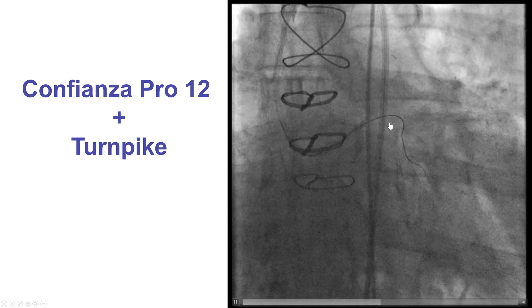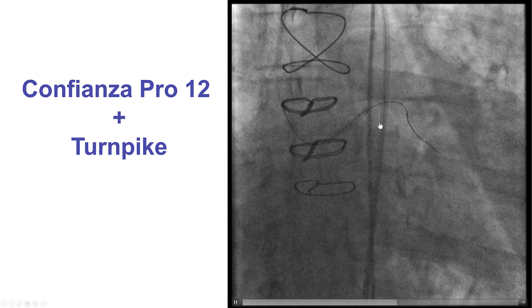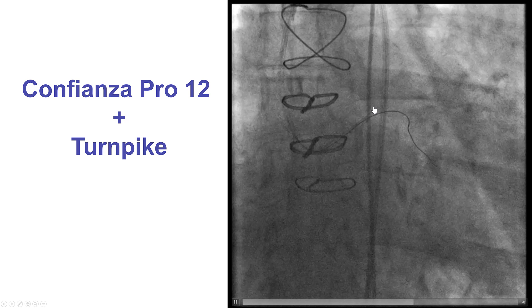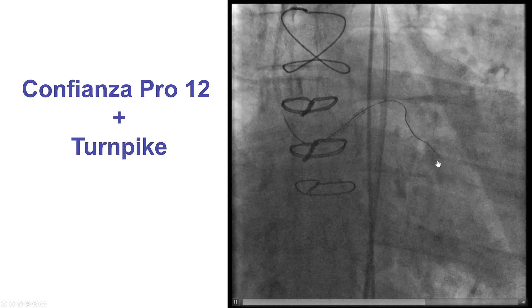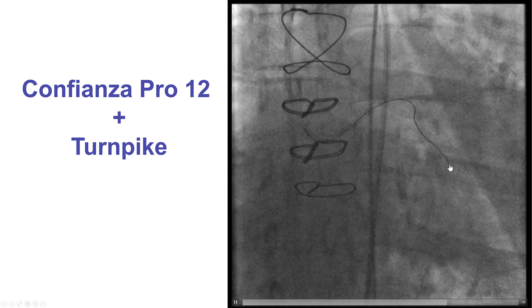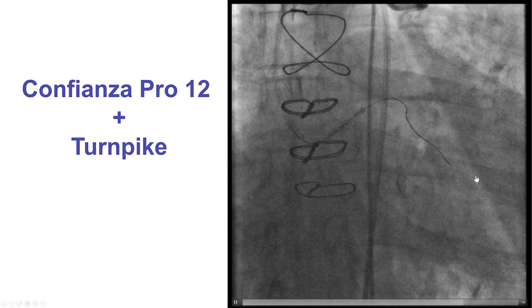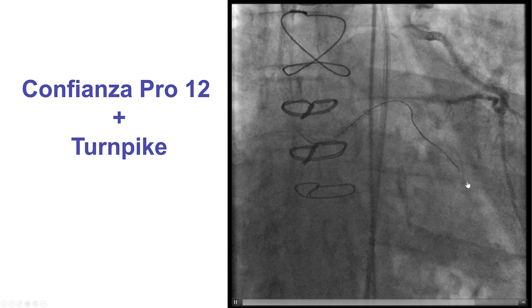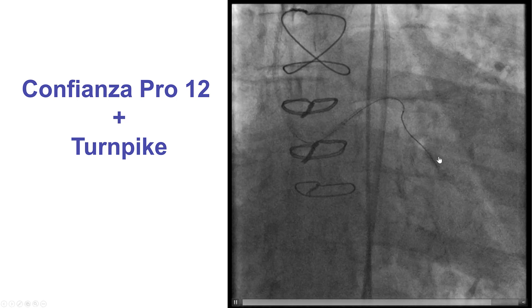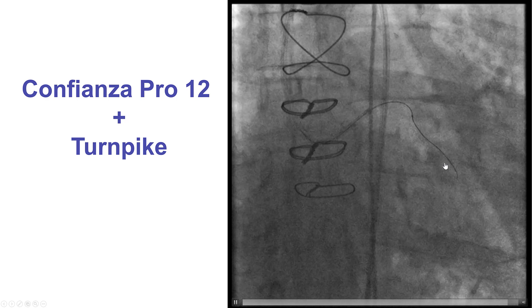We did have bilateral femoral access with an 8 French EBU on the left and a 6 French guide for the internal mammary graft. After multiple attempts, the wire did seem to follow along the course of the obtuse marginal branch, which was the main branch supplied through the epicardial collaterals. So this was a very appealing location for attempting re-entry.